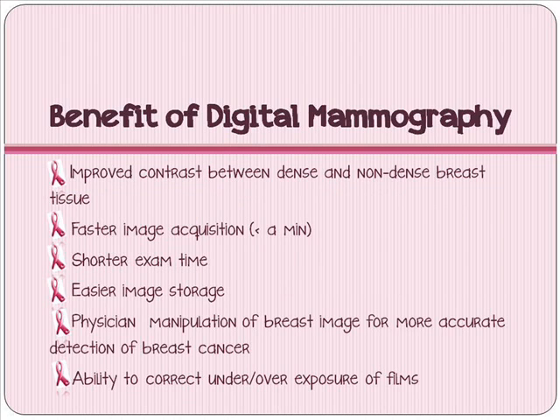Even though digital mammography is highly expensive compared to conventional mammography, digital mammography provides a lot of benefits in the hospital right now. Digital mammography improves contrast between dense and non-dense breast tissue.